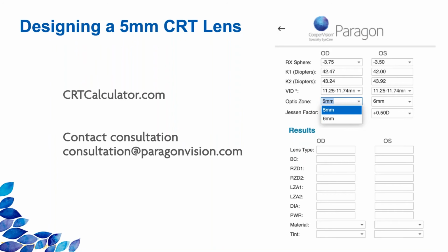If you are interested in designing a 5mm optic zone diameter lens, you can visit crtcalculator.com, and you'll see the calculator on the right-hand side of your screen right now. These are the same entry parameters if you're used to using our prior calculator, requiring the RX sphere, the K values, the VID, and then the optic zone will automatically be set to 6mm, but if you use the drop down, you can go ahead and change it to 5.